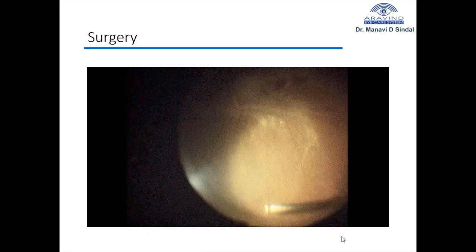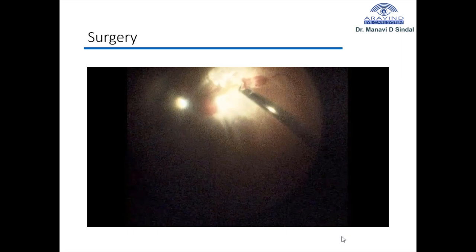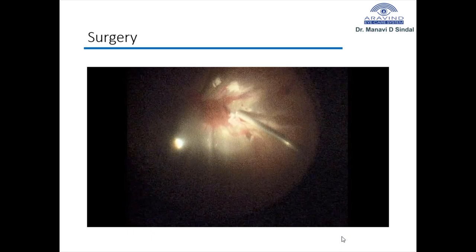This is a patient with a far more advanced disease where there is an extensive membrane which is completely adherent and the entire retina is detached off, and this needs a lot of manipulations, and you need to do a lot of things to slowly dissect out of the membrane with forceps, with scissors and with the cutter to clear these membranes from the entire surface of the retina slowly and gradually, painstakingly, and then the retina is slowly attached back in position.